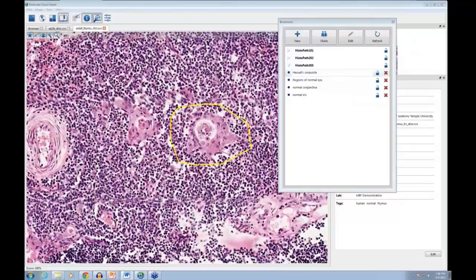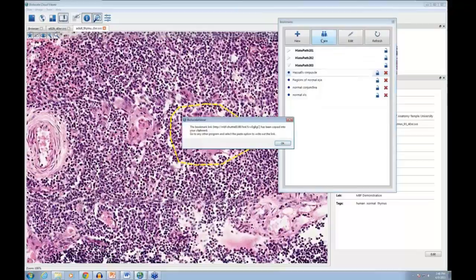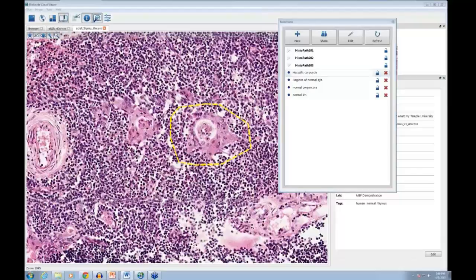So to summarize: you've taken slides from your overall server directories, made special collections, copied images into them, annotated specimens, and then saved those magnification levels and locations by bookmarking them. These bookmarks can then be shared — clicking 'Share' copies a URL directly to your clipboard, which you can paste into other applications like Word, an HTML document, or Blackboard — for instance, embedded in a question.